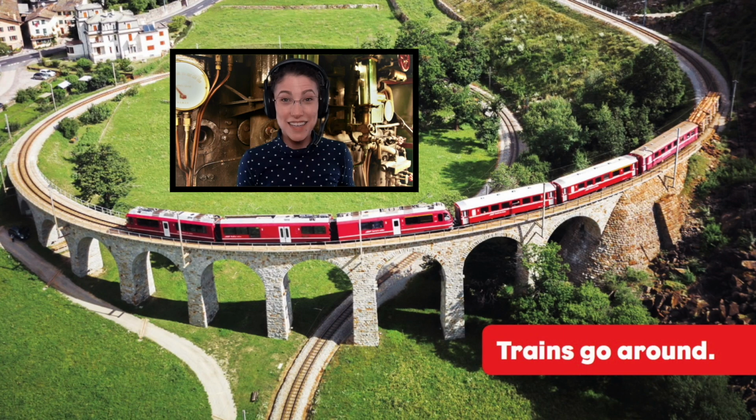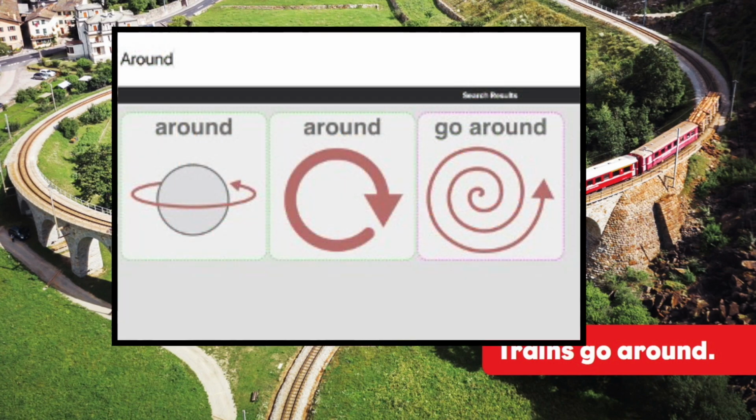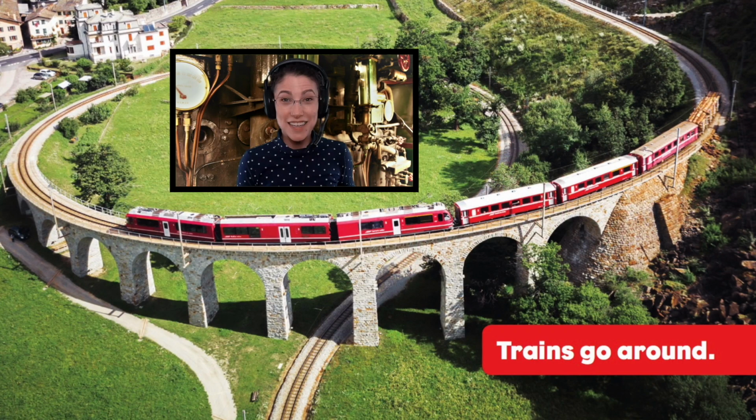I typed the word around. See how my search results are grayed out and the edges are dotted lines? This shows me that the buttons are already in the system program, but aren't available to me on the current settings. If I had a larger grid size with smaller buttons, more words would be on each page, and these might be available to me. We won't be adding new buttons right now, so how do we cope? We choose other things to talk about.